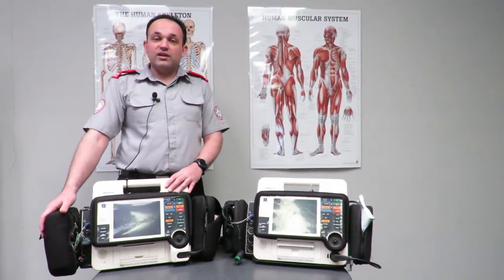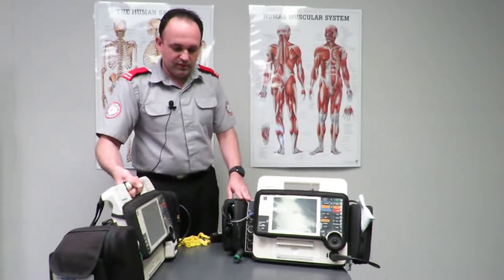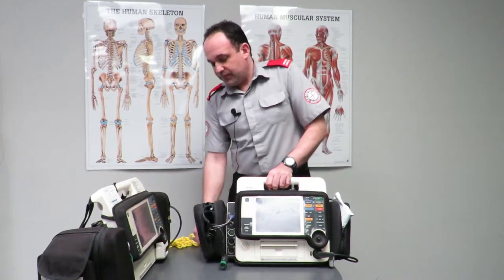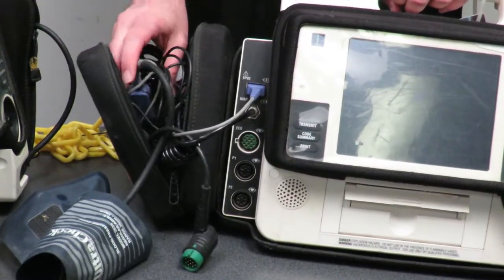On the left-hand side of the unit you have all your diagnostic equipment. If you open the pouch up, this is where you'll find your blood pressure cuff, your pulse oximeter, and your ECG cardiac monitoring leads.